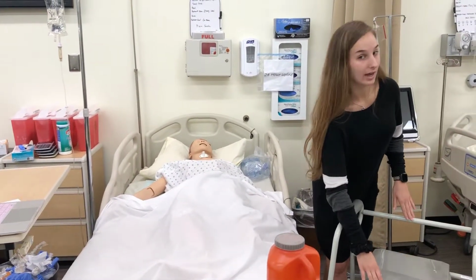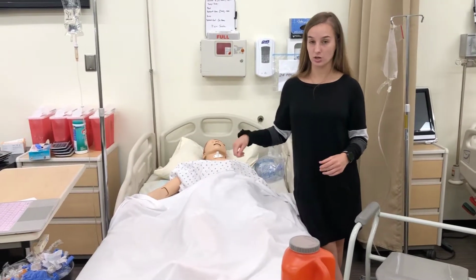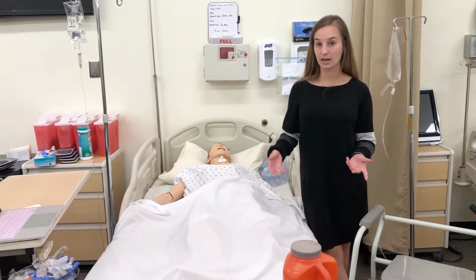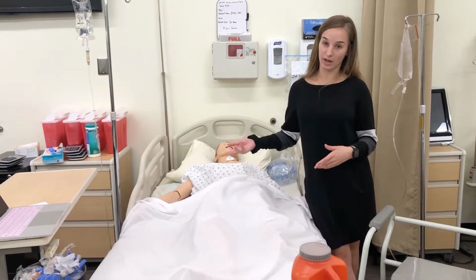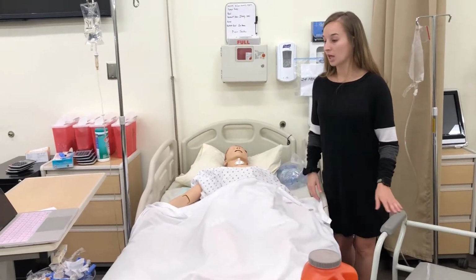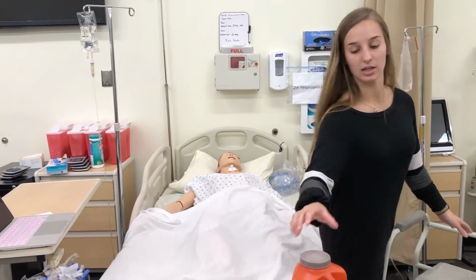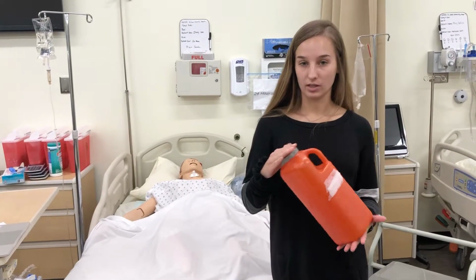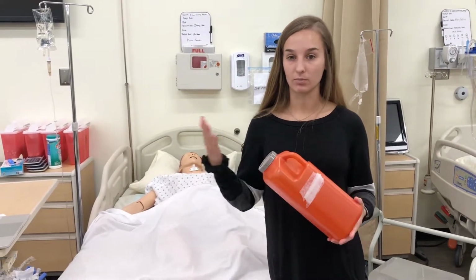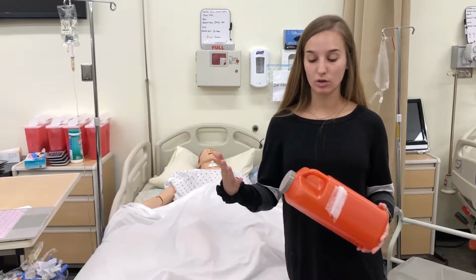If they were immobile, I'd have to do a sterile procedure and either use a straight cath or maybe obtain the urine from their catheter bag, because they wouldn't be able to get up and come to the bedside commode. After I have all 24 hours of my urine collected, I would send this off to the lab for them to test for the amino acids, adrenocorticosteroids, the ketones, and the glucose.